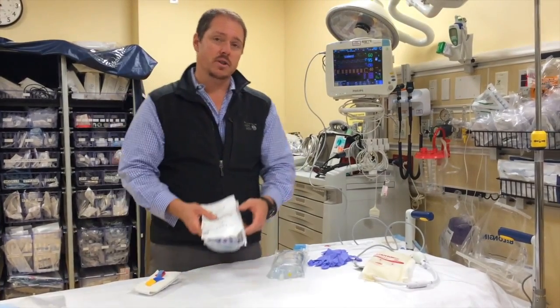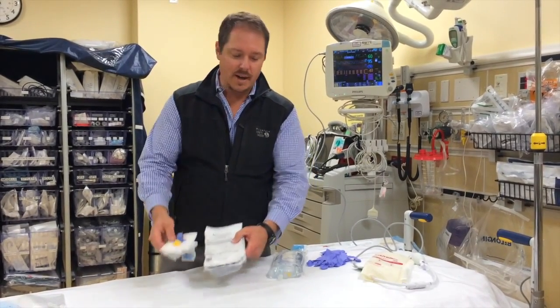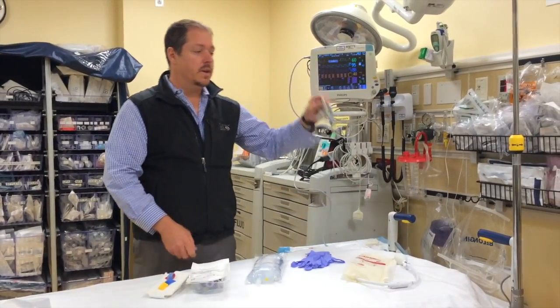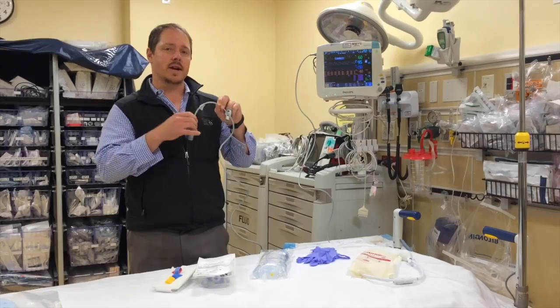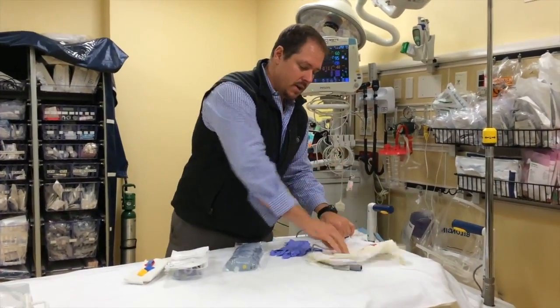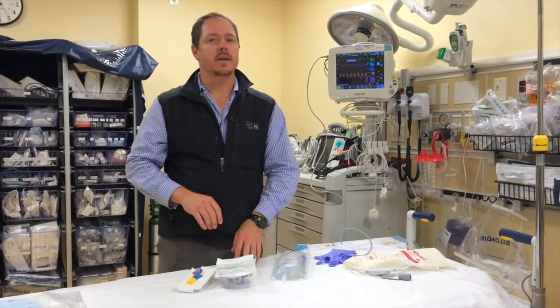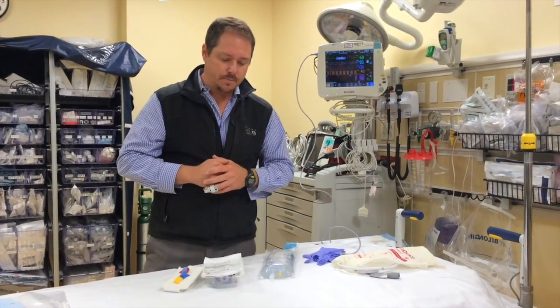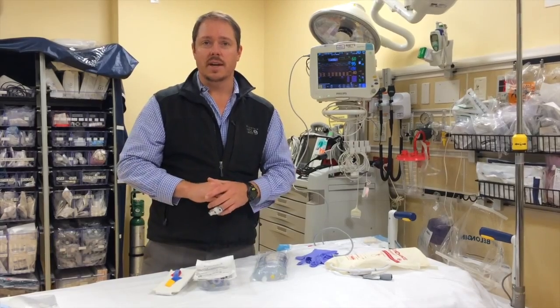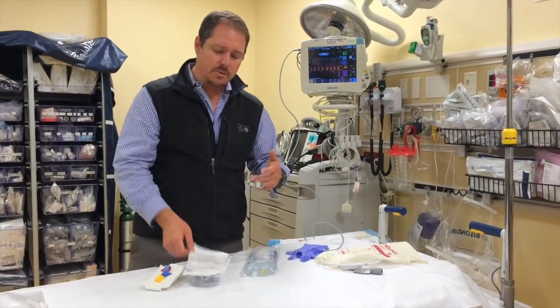The way the setup goes, basically, is you need special tubing. You need an arm band to hold into the phlebostatic axis. You need a nice bag of normal saline — we don't use anything heparinized in our ED. You need your pressure transducer connector for our Phillips monitors, a pressure bag, and good hand washing and gloves. This is all going to go into a central line, so it's important to be as aseptic as possible, even while just setting up the line.